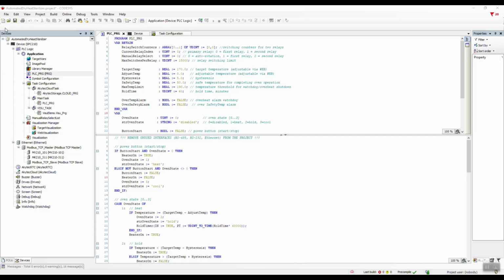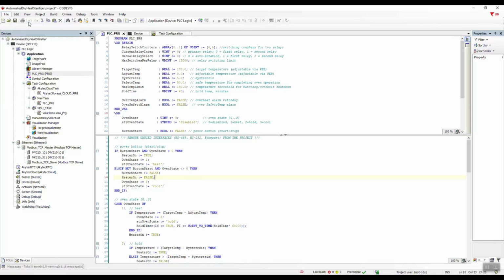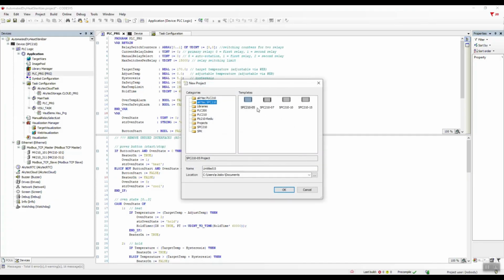a project from scratch. To do this, you need to click on the File button and select the New Project command. Note that in the window that appears, you not only have the option to choose a standard project, but also ready-made project templates for akYtec devices. In particular, here we see the SPC210 Touch programmable controller, which we will be using. This means that the manufacturer has pre-configured projects for each modification of their equipment.